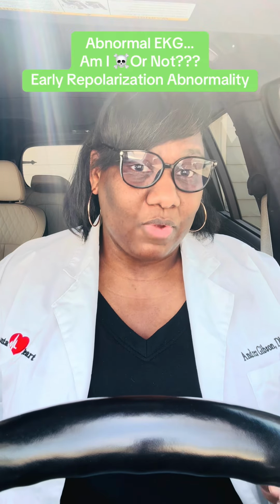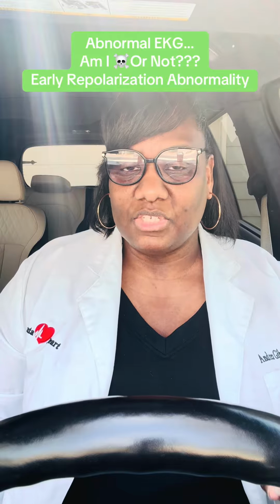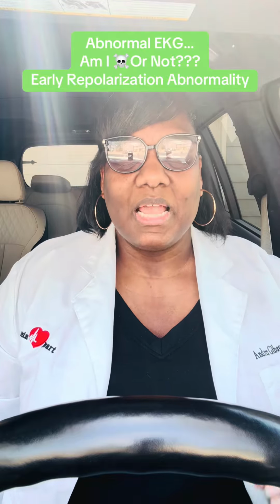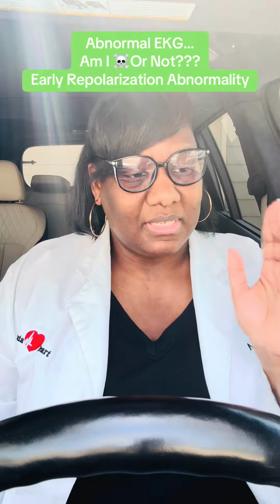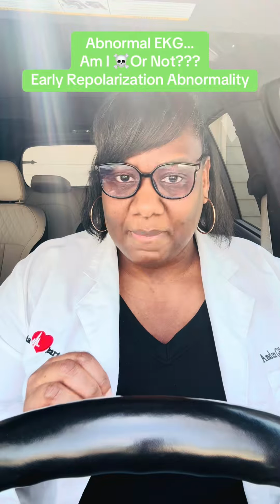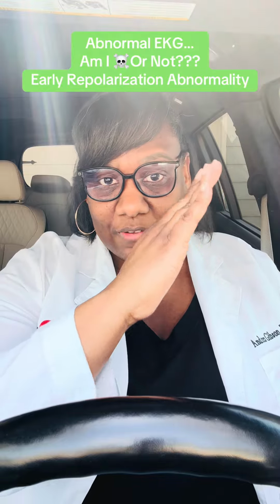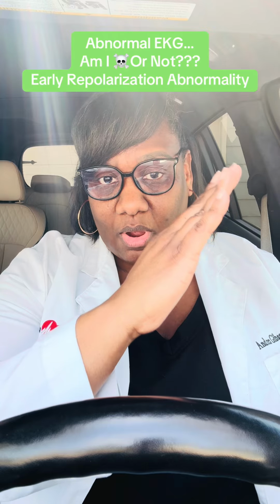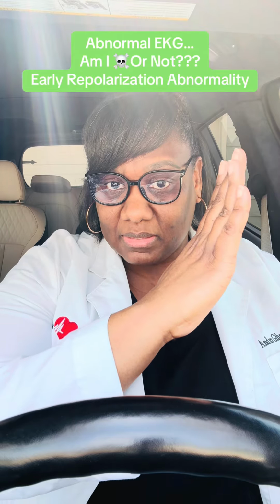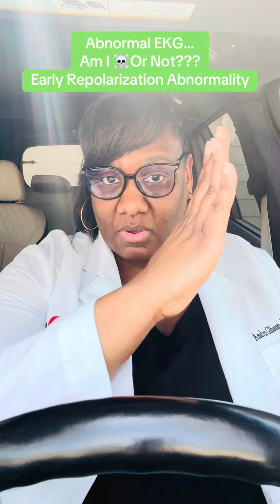Now, early repolarization changes are often misinterpreted for STEMI because they both come with elevation in the ST segment, but the elevation looks very different. In a true STEMI, you are going to have a very flat ST segment elevation, like that, flat. With early repolarization, you are going to have a concave upward bend in your ST segment. STEMI, early repol. STEMI, early repol.